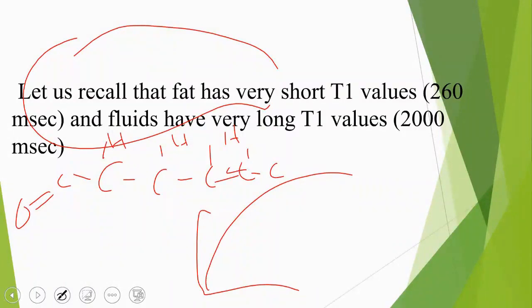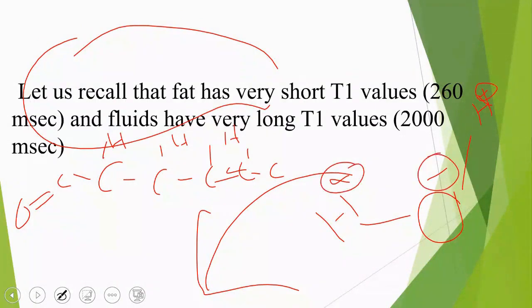As a result, the heavy molecules have their motion facilitated in a manner that is significantly influenced by the bound molecules, which notably eases the energy transfer between the molecules. On the other hand, when talking about water, the oxygen is bonded to two hydrogen atoms, so its protons are particularly influenced by the oxygen, which has a negative charge. This negative charge creates a strong attraction for the protons due to the magnetic field produced around the oxygen, which has a higher effect on the protons, causing them to rotate faster than the protons present in fats in this scenario.